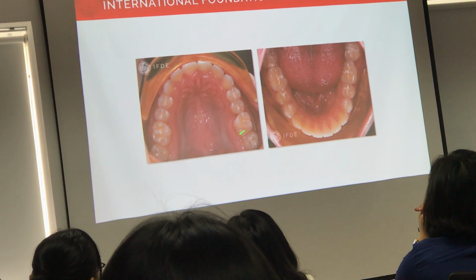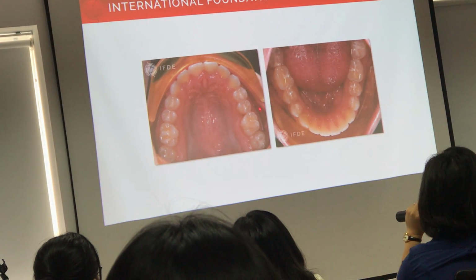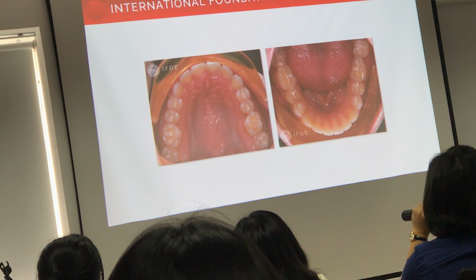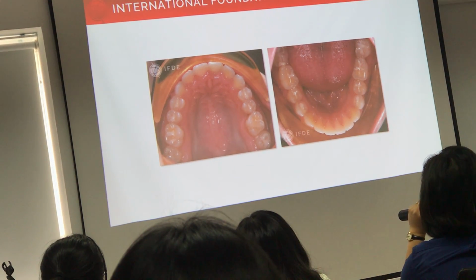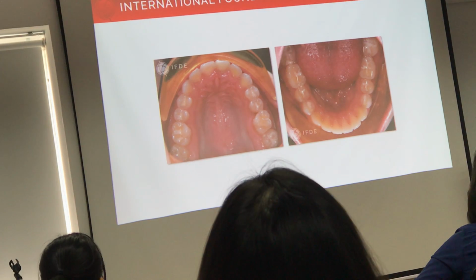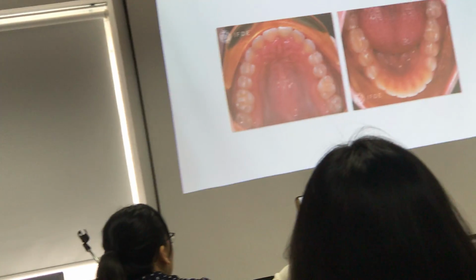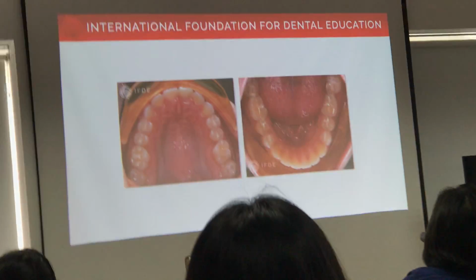Alright? And again, screwed up here. TP bar. Here we see this tooth is still rotated, so next time we should use the TP3. Even with the forces, it still didn't rotate. I don't know why. We see that even when I used that force, the tooth still rotated, and I don't understand why.